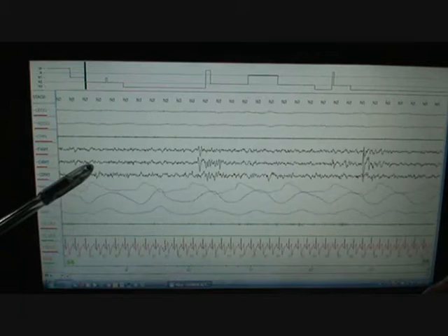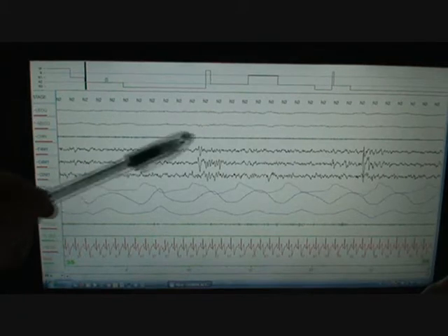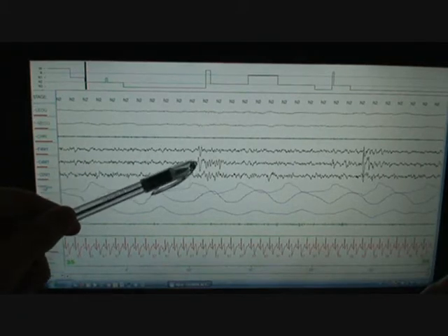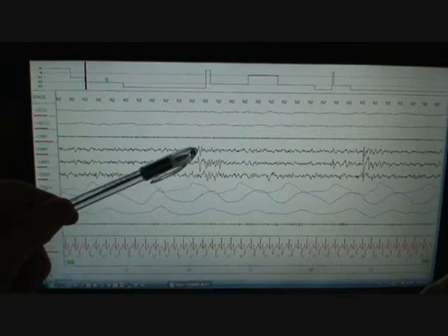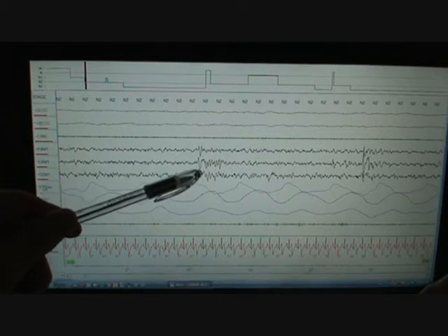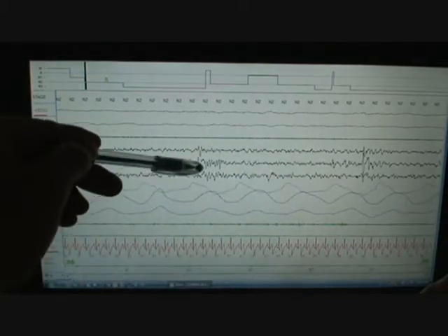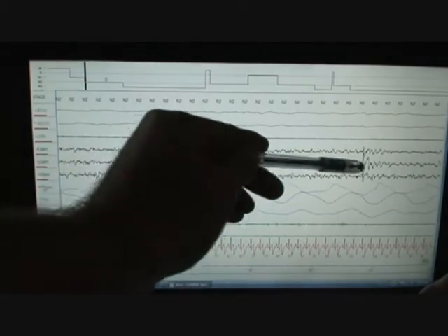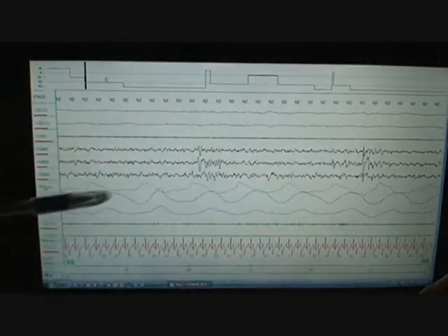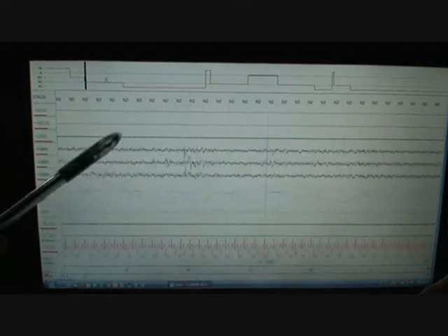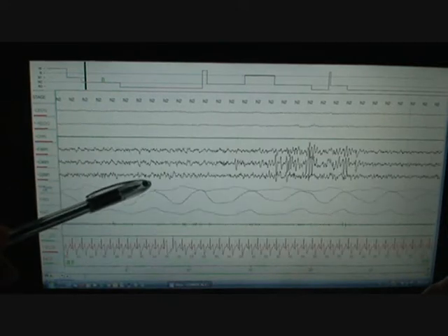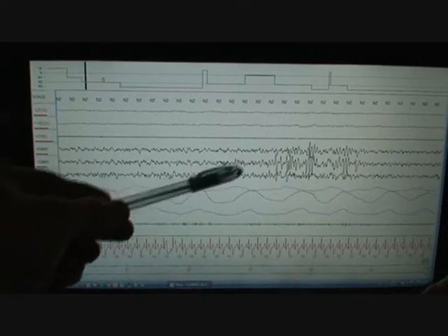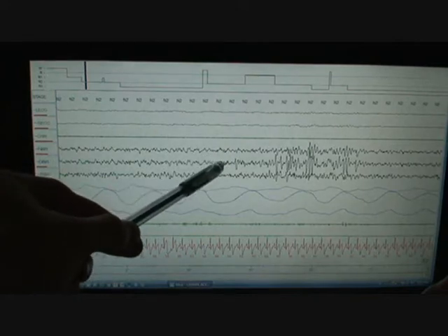Now we call this two, because right here you can see a sharp negative. Negative is up, negative deflection, followed by a sharp positive deflection. It's a sleep spindle. You see another one, I'm sorry, it's a K complex. You see another K complex over here. That's indicative of stage two. So we start calling this stage two. Now here's a sleep spindle. It's not a great one, but it's a sleep spindle.